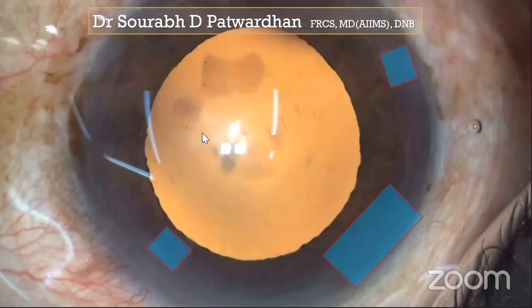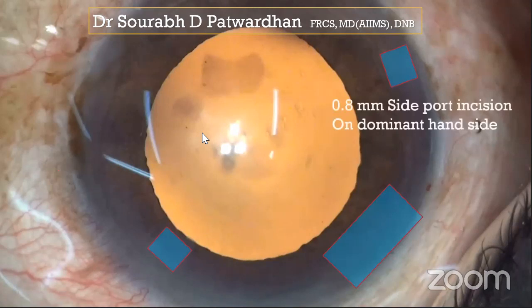For the beginners, I recommend making two side port incisions, around 0.8 millimeter in size. So we don't need very large side port incisions. This reduces the risk of visco leakage when you are doing capsulorhexis, and that is paramount because it keeps the anterior chamber stable. All the vectorial forces over the capsular edge are very stable, and there is no outward movement of the capsulorhexis edge if the anterior chamber is well maintained.